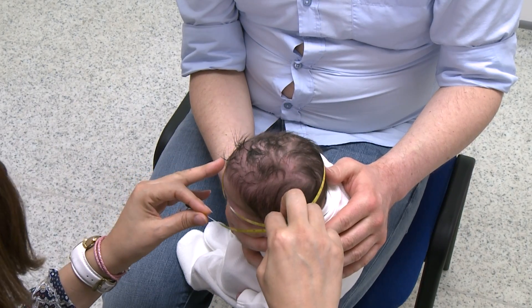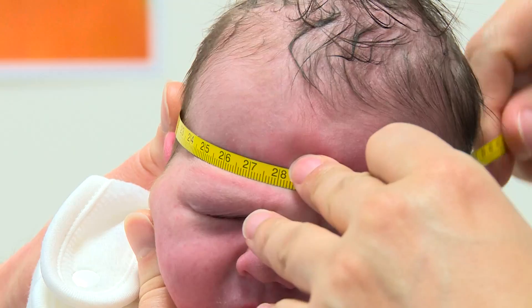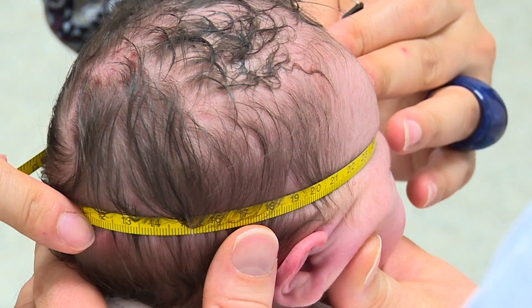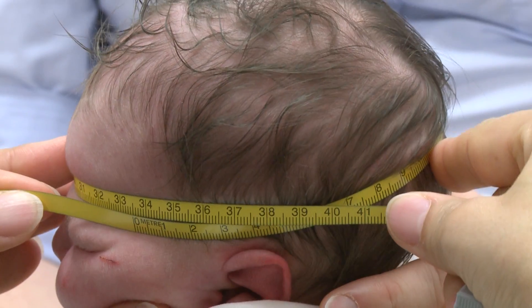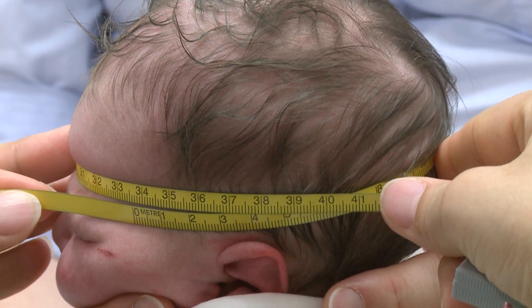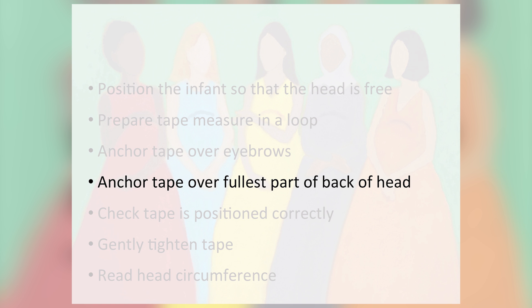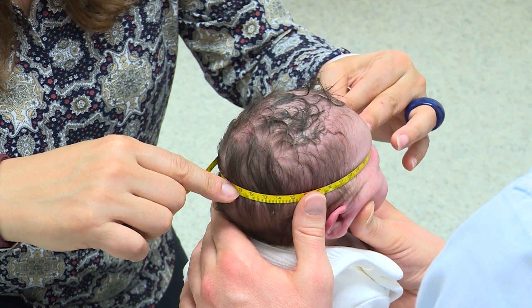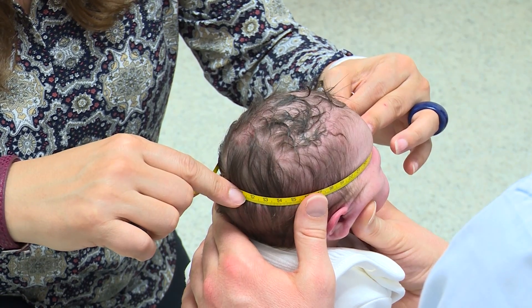Crouching at eye level with the baby, position the tape around the baby's head, with it lying just above the baby's brow line and on the fullest part of the skull at the back of the head. The zero should be somewhere by the side of the head. The assistant holding the baby needs to ensure that the tape is lying flat, not lying over the ear on their side, is level and not slanted.